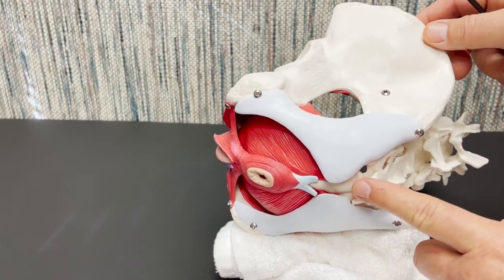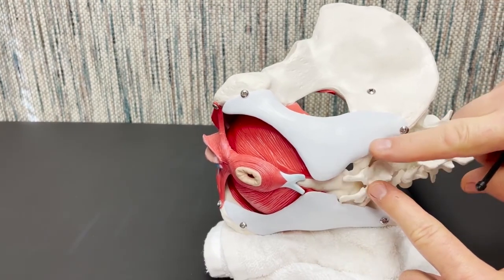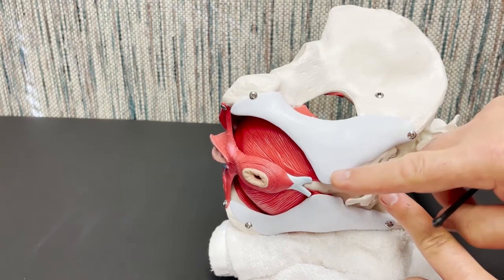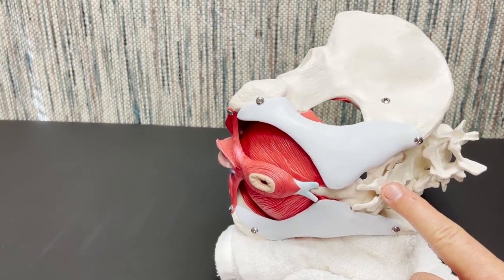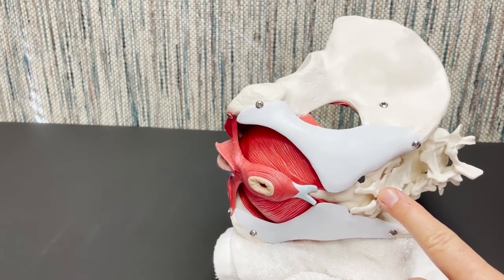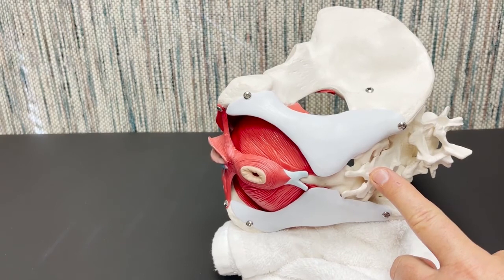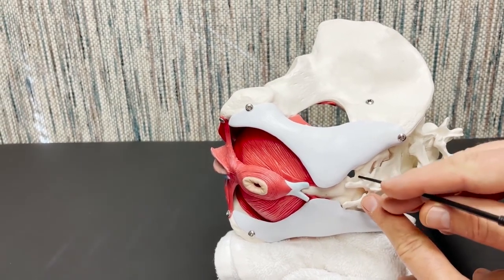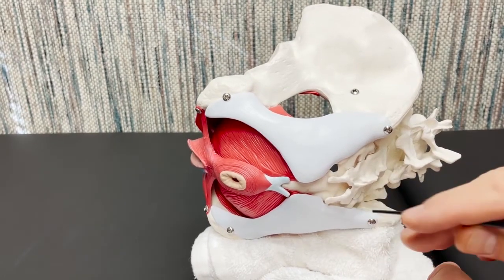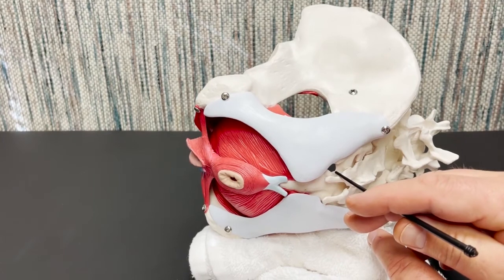So here we have our sacral horns. We've palpated our lateral sacral border, which is underneath the ligament here. So we're going to insert a needle posterior to anterior, slightly lateral, where we palpated the sacral horn to determine needle depth at the sacrococcygeal junction. So here's the junction of the sacrum and the coccyx. We're going to drop a needle just lateral to land onto that junction.